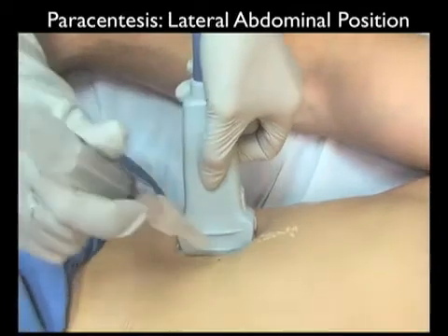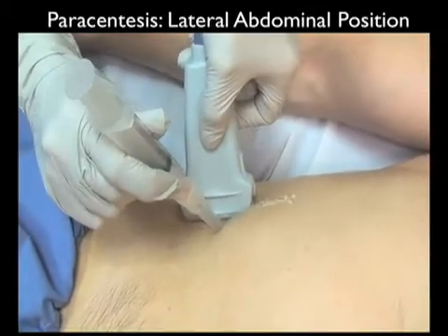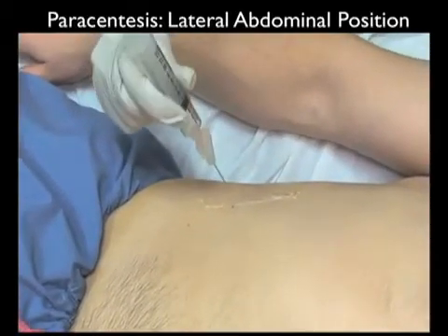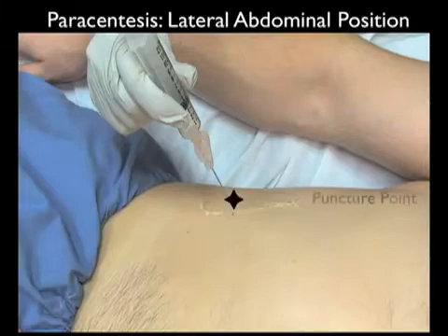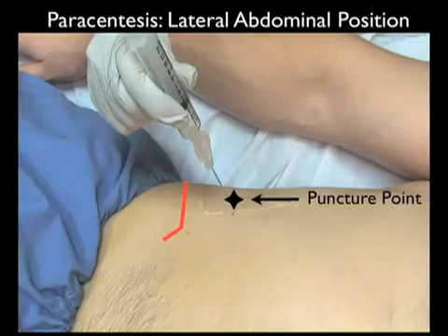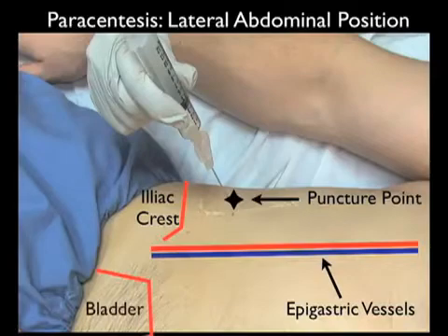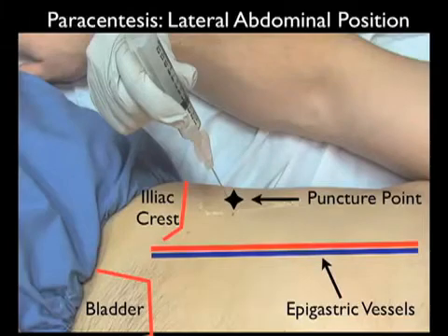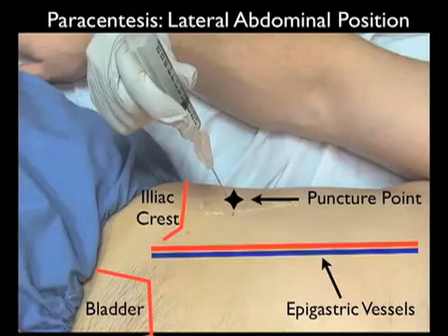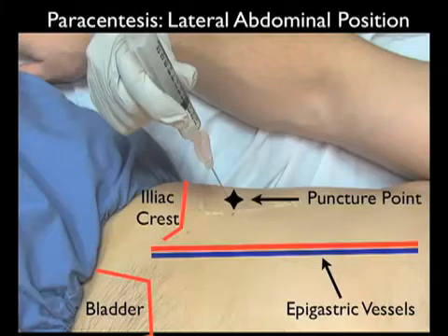In this video clip we'll reemphasize the surface anatomy for the lateral abdominal position for paracentesis. Note we're coming with a capped needle underneath the 10 MHz probe at the lateral puncture point — the preferred position for the lateral approach, shown by the black star. Palpable surface anatomy includes the iliac crest; we're about 4 to 5 centimeters above it. We also want to avoid the epigastric vessels, visible medial to the puncture point. Using ultrasound guidance we can map the best position and go either right or left depending on the maximal ascites pocket, and we want to ascertain the relative locations of the liver and spleen to avoid solid organ injury, as well as the intestine with anchoring mesentery to avoid intestinal puncture.